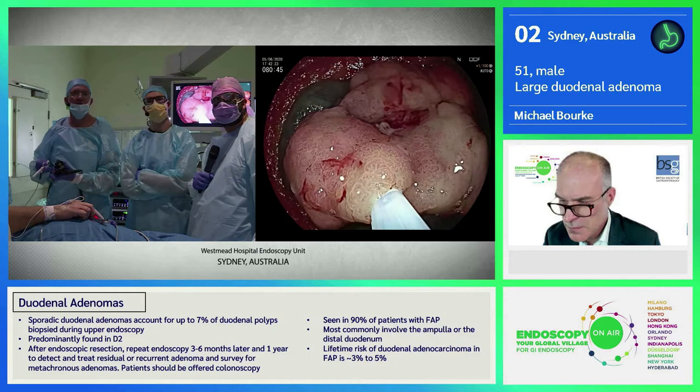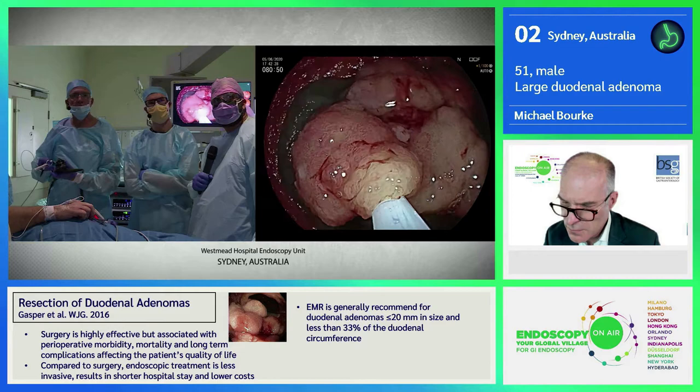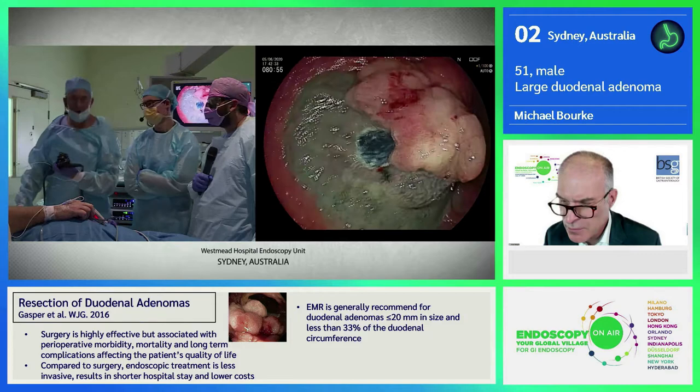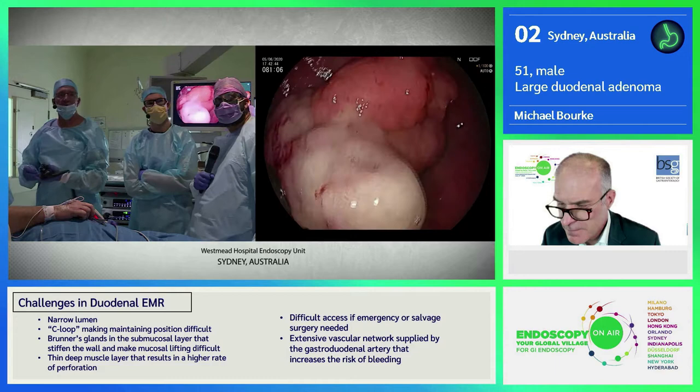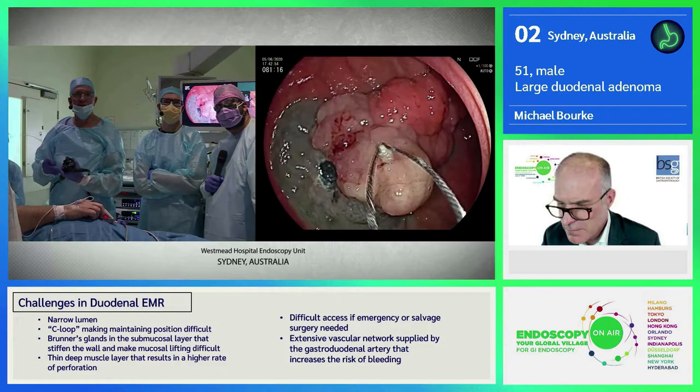So again, we check the mobility. And then just your diathermy setting there, Michael. What diathermy are you using? Same settings as we use in the colon. And water jet into the defect. And we do the same thing. We do the snare tip here as well. The snare tip has reduced recurrence, which historically is around 20% to zero in a cohort of 50 patients with polyps like this.